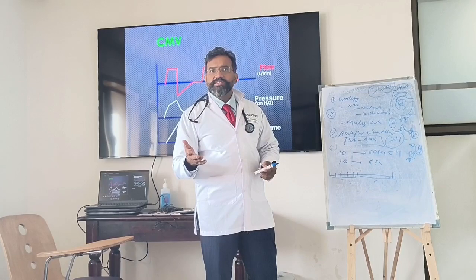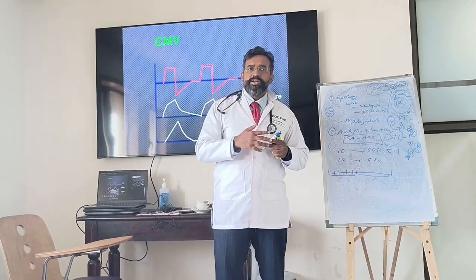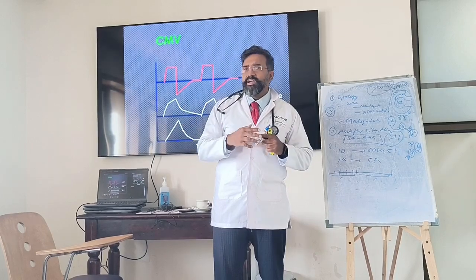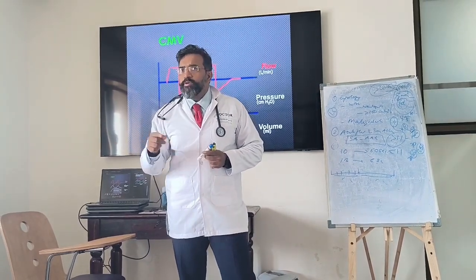So what will happen with this? Asynchrony. The patient will get tired. These patients will have a prolonged ventilator stay, neuromuscular weakness, and will develop other kinds of problems. They will develop atelectasis. Are you understanding? That should not occur, and that is what you want to figure out by looking at your graphics.